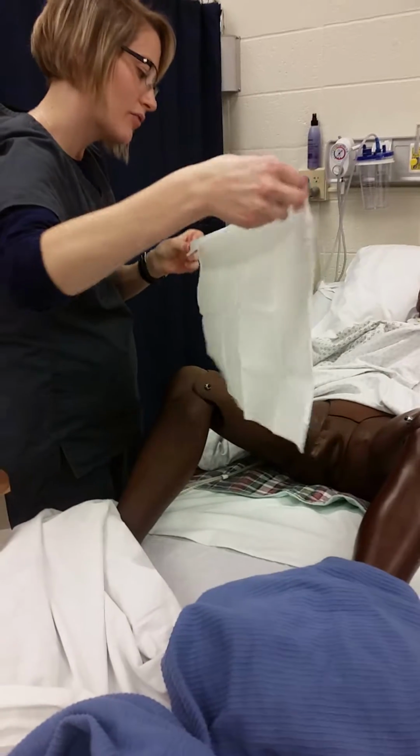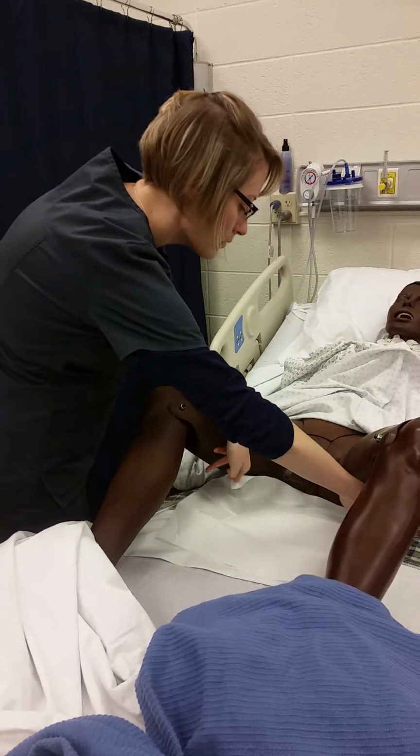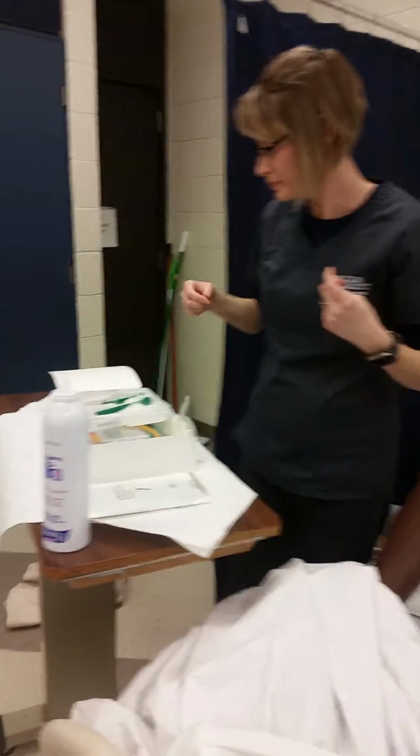I would ask the patient to lift their buttocks up if they could for me. If they can't, I would have somebody assist me to do that. And I'm just going to drape this underneath their bottom to protect their sheets and keep a sterile field.